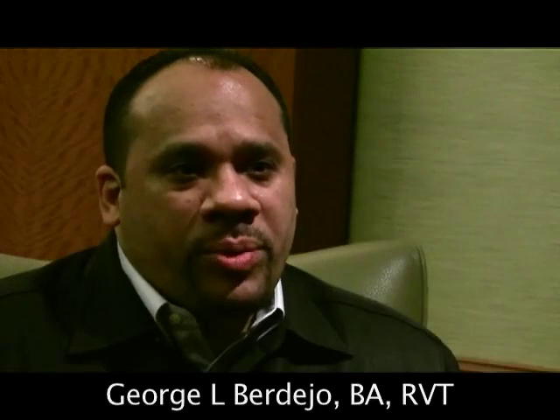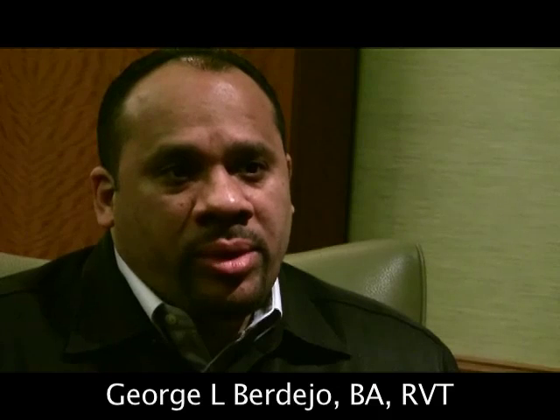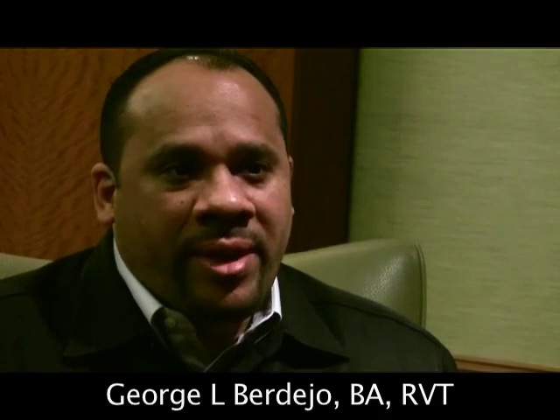Hi, my name is George Berdejo, and I am the Director of Vascular Ultrasound Services at Montefiore Medical Center in New York City. Today I'll be going over with you techniques and protocols for the use of duplex ultrasound in the evaluation of the carotid arteries.